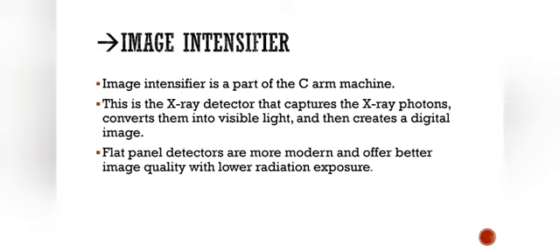So nowadays the image intensifier is modernized into a new version and it is called the flat panel detectors. These flat panel detectors are more modern and offer better image quality with lower radiation exposure.